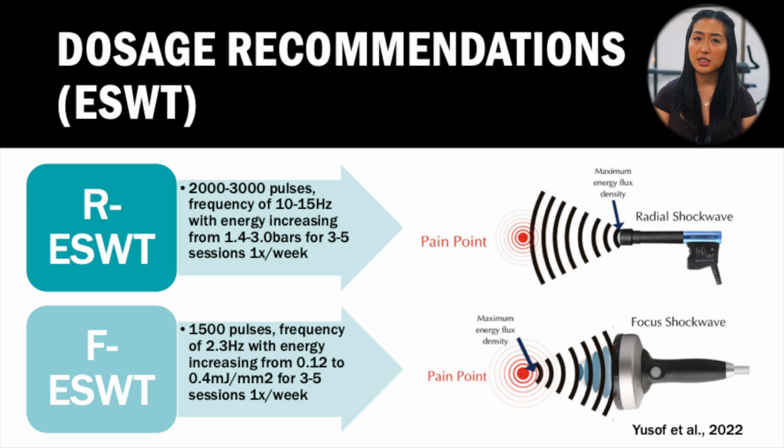And of course, this is just a guideline. In my practice, I do typically see patients for longer lengths of time, usually anywhere from 4 to 12 sessions once a week, because this length of time allows me to progressively build them an exercise program and allows me to monitor my patient's progress and exercise technique to be used in conjunction with shockwave therapy.